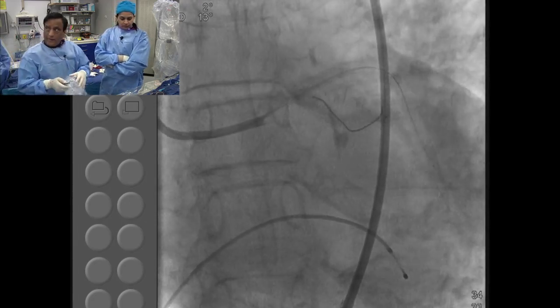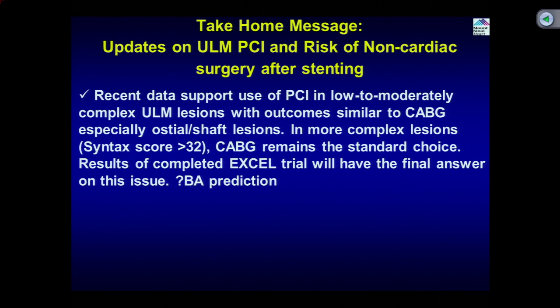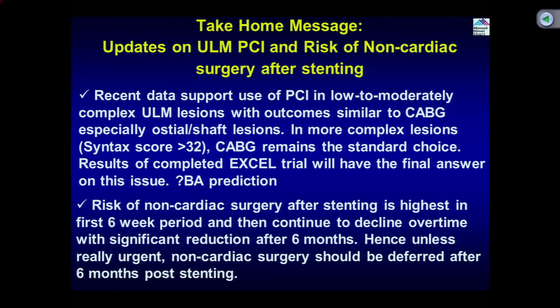To summarize and conclude: the patient has a type B proximal dissection. We will wait to assess the proximal edge. The final message from Anu — where does OCT stand with regards to imaging in PCI? In the United States, it has not made it to the guidelines yet. For questionable lesions, you still go with FFR or IVUS. The OCT is still mostly a research tool in the US at this time, though it has made it to the European guidelines.